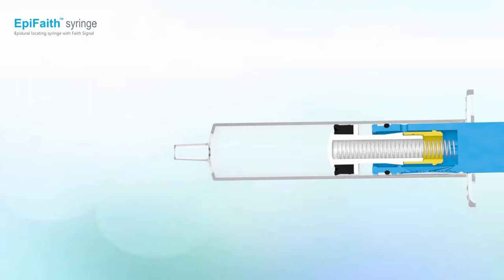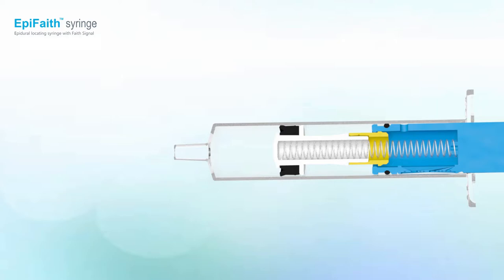During LOR, the balance between spring force and pressure is neutralized. The piston rubber will move forward, revealing the collar ring.